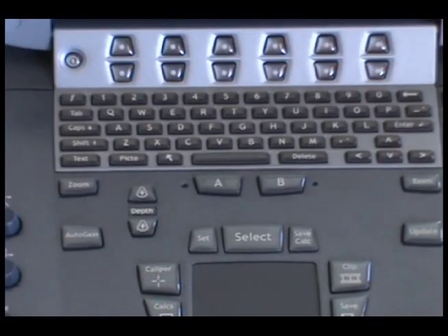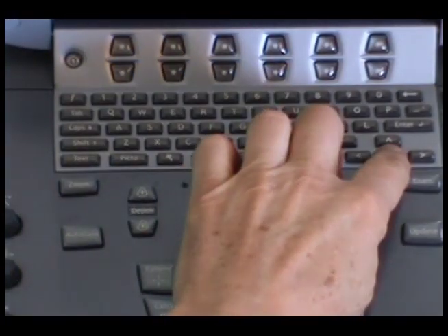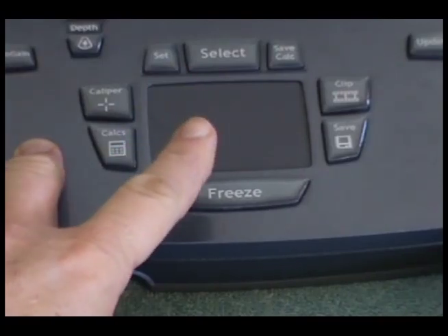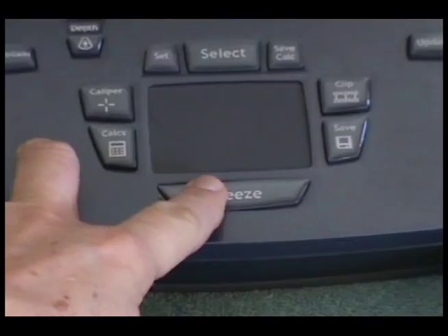Adjust gain for the best image. And adjust focal points to the bottom of the organ of interest. Remember to keep one finger of the keyboard hand on the freeze button, ready to capture the best image.